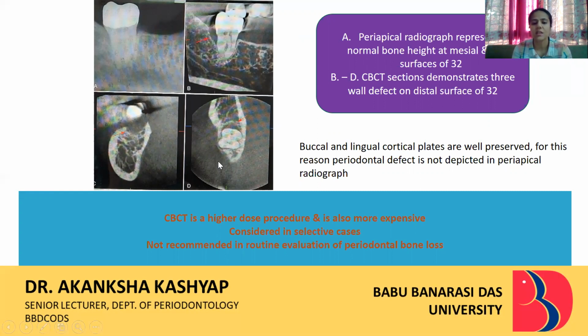But CBCT is a higher dose procedure and is also more expensive. So it is not considered in each and every case. It is considered in selective cases only, and it is not recommended in routine evaluation of periodontal bone loss.